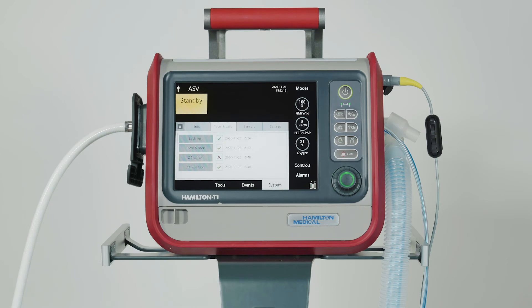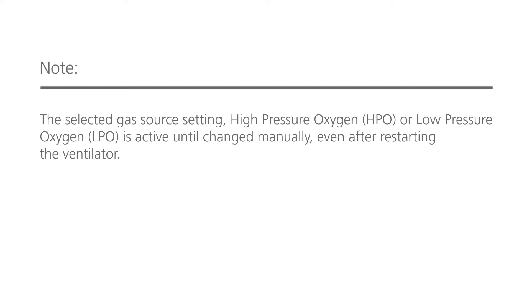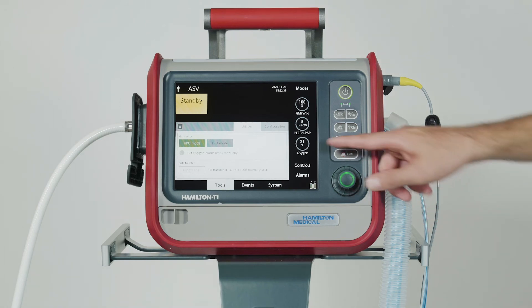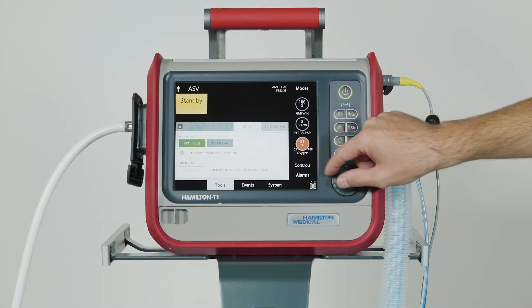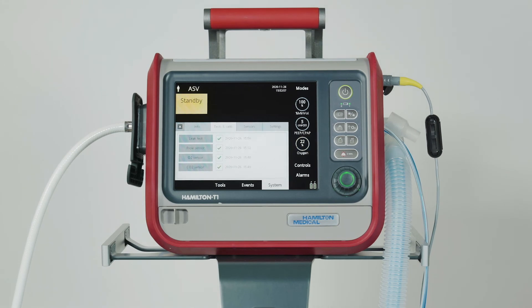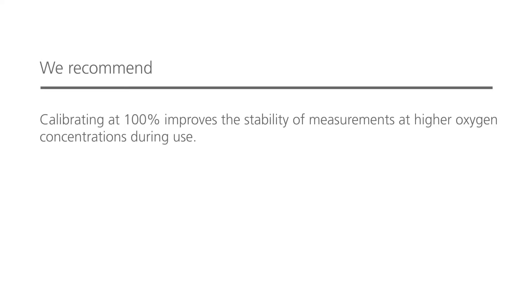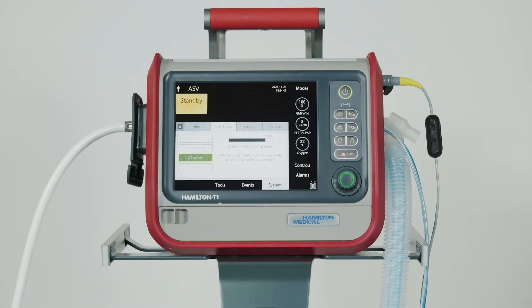First, select the appropriate oxygen source and make sure oxygen monitoring is enabled. To calibrate the sensor with 100% oxygen in standby, set the oxygen control to 22% or higher. The high pressure gas source needs to be connected. When calibration is complete, you should see a green check mark in the O2 sensor checkbox.